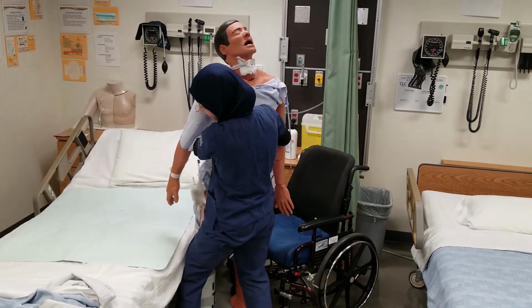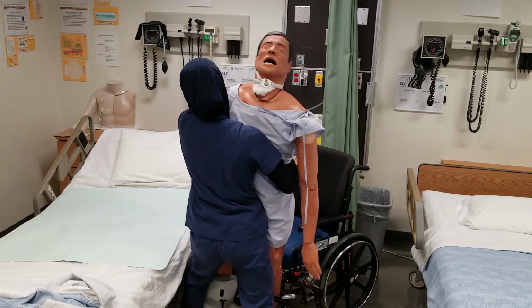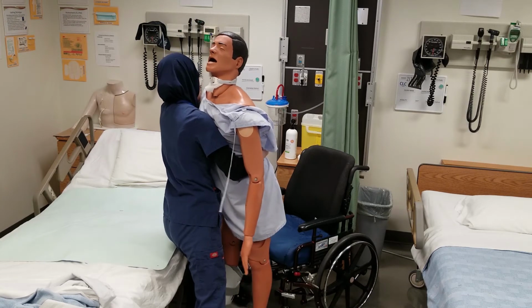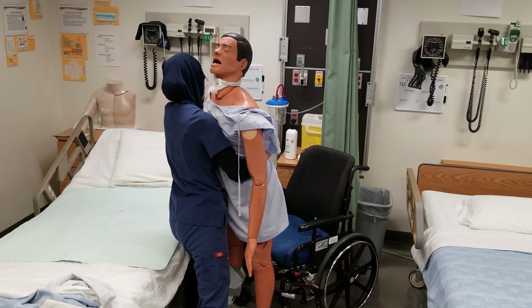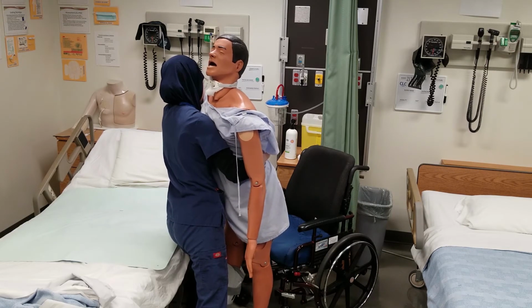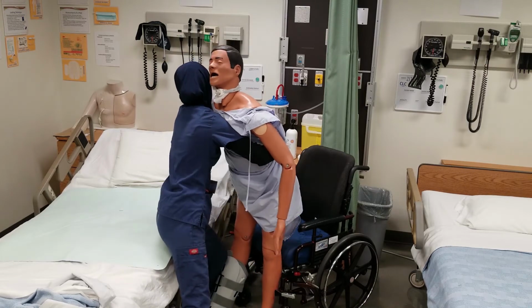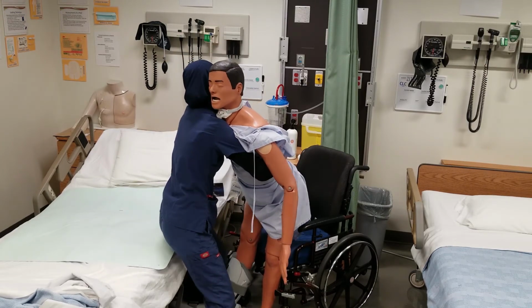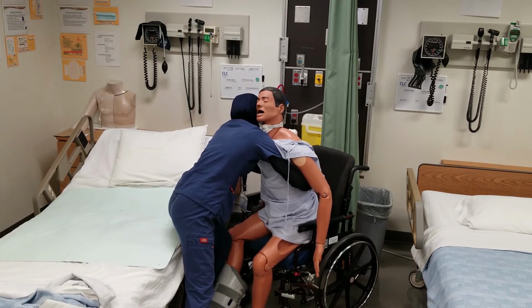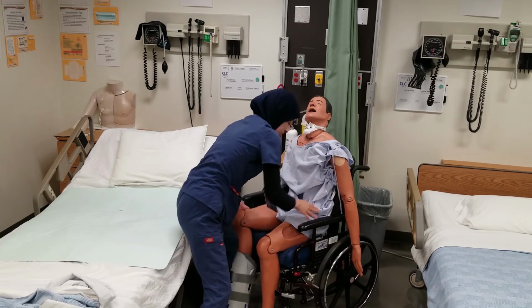All right, now we're going to pivot. So I'm going to pivot my back foot, pivot, and then I'm going to say, Chris, when you feel the chair at the back of your legs, just reach down behind you until you can feel the armrests. So once you feel the armrest, just slowly let yourself into the chair. And I want you to scoot all the way until your back hits the back of the chair. So now he is in the chair.